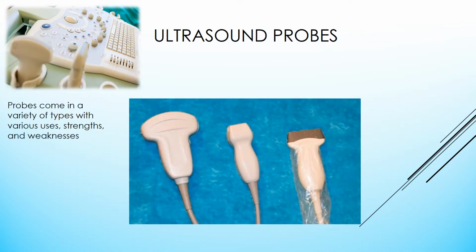Know your limits of what you know and what you don't know, and consult a specialist when practical. Probes come in a variety of types with various uses, strengths, and weaknesses. To the left, we see a curved probe. In the middle, we see a phase array probe. And on the right-hand side, we see our standard linear array probe.